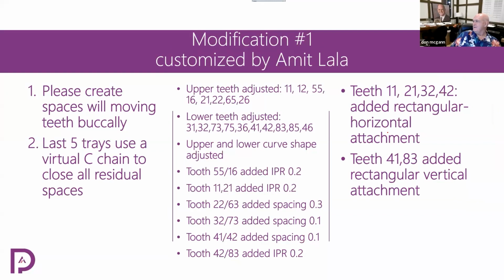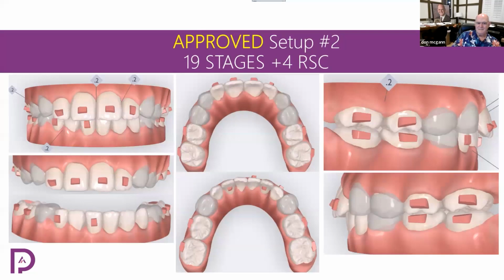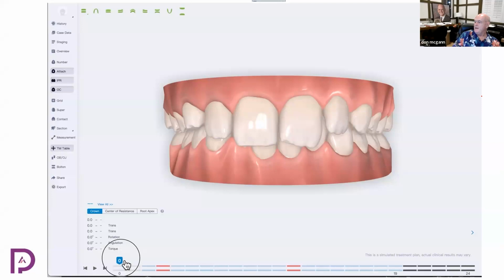but then I gave it to Lala, and Lala went crazy. He adjusted all kinds of teeth. This is a custom adjustment, and he went absolutely crazy. He adjusted every tooth, which that's okay, but he didn't have to. But anyway, he changed everything. IPR, added spacing between teeth, changed attachments, that sort of stuff. So that's what was done. And I'm not arguing that it didn't need more. It's just, do you have to go that much detail for your first series in the mixed dentition? Answer, probably not. Okay. But at some point in time, you're going to refine everything.